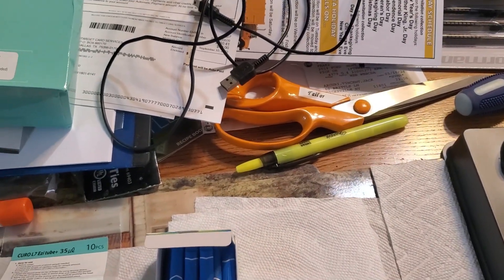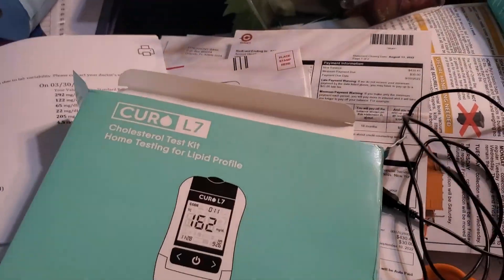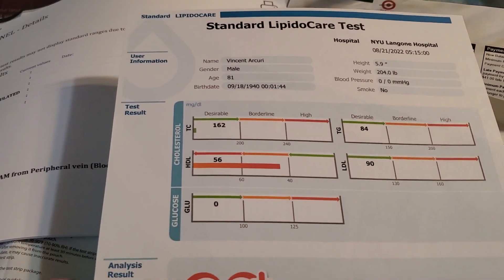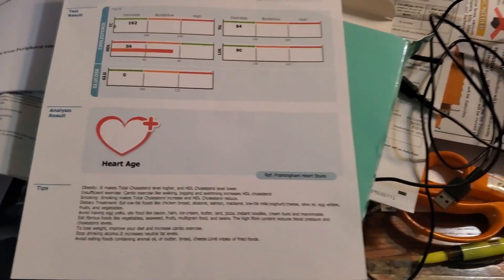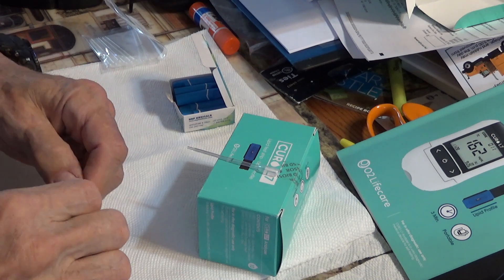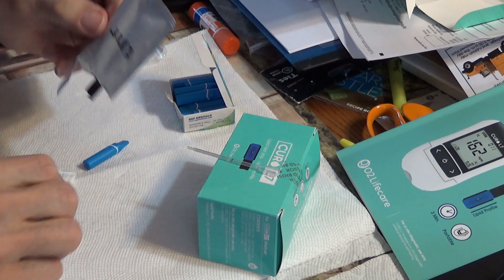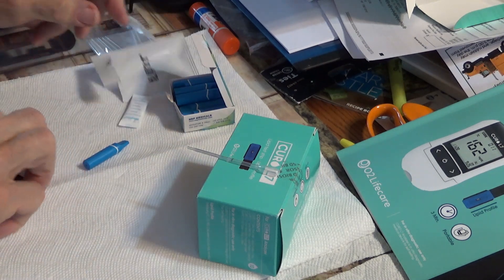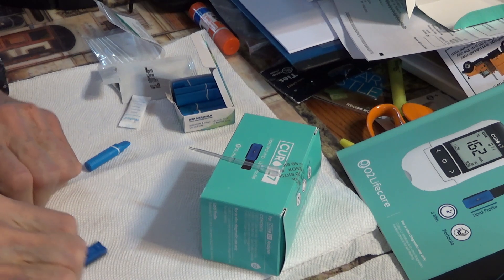I'm going to show you the software — how to get the software. The software will print out results like this; I printed this. Now I'm going to open the strip. There's the test strip.